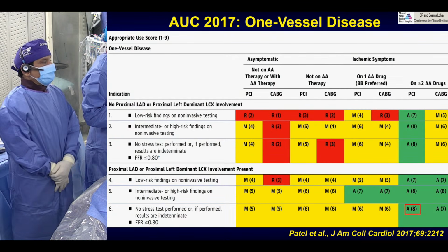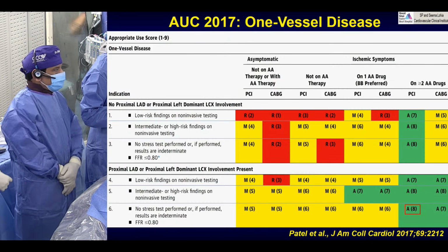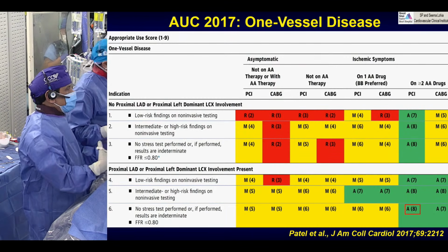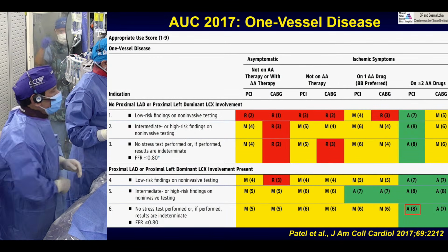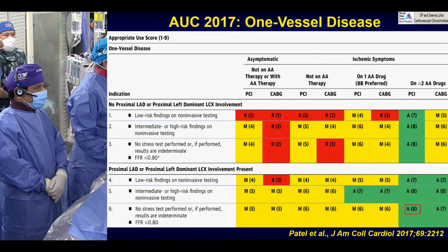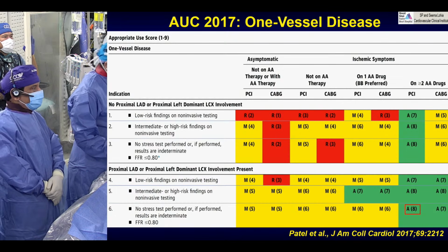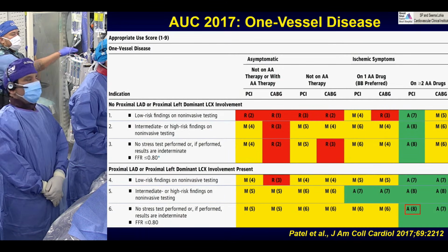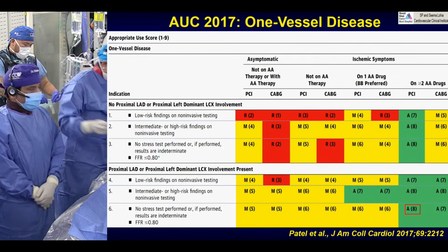Now the question always comes: if you have a CtFFR positive, less than 0.8, do you do the angio FFR? As you know, Medicare does not reimburse you if you have a CtFFR positive. Other insurance companies are okay, but Medicare does not. They say that CT is quite predictive, and if it is positive, you do not need to do the FFR. But many times I personally feel that it overreads, because there is very diffuse distal disease, mild disease, and it becomes positive. As a matter of fact, this Sunday I had two patients, both CtFFR positive at the LAD, and the lesion was barely 20%.